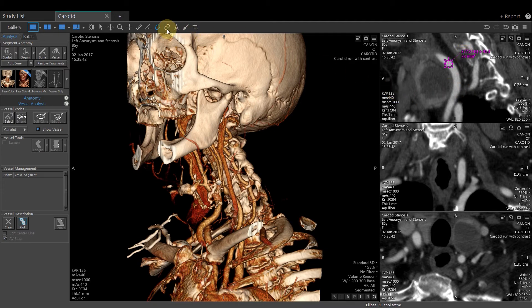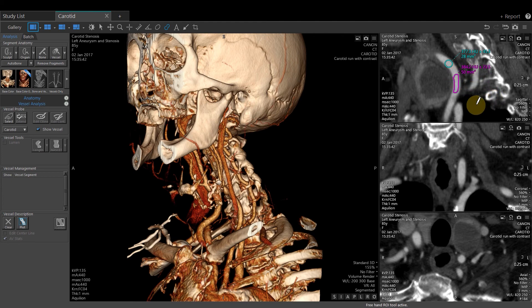We can also use the freehand ROI tool to contour a different area of anatomy if needed. Let's try it.